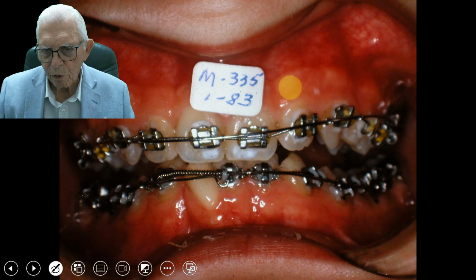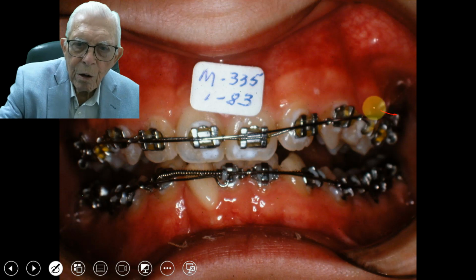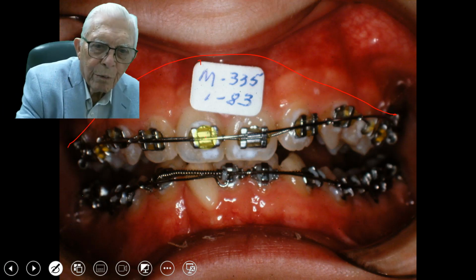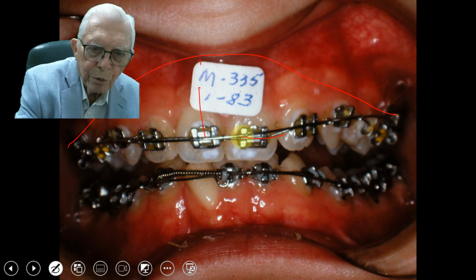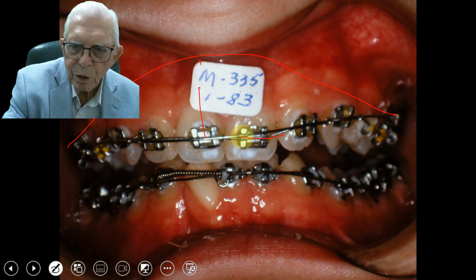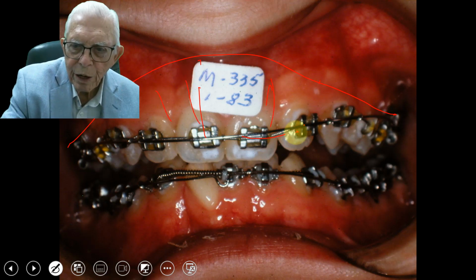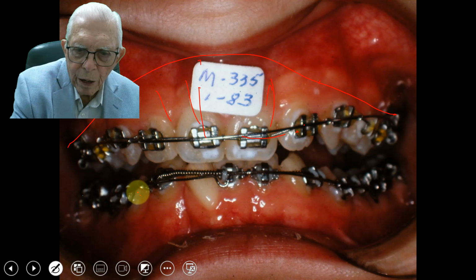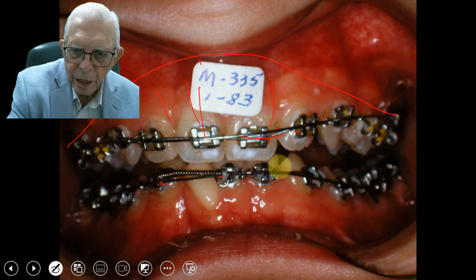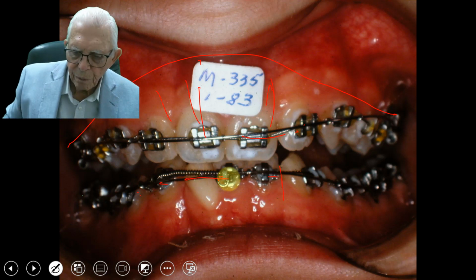Now here we're going to cover how we did this thing. Now this is an intruding arch wire, which goes way up like this, and you're really raising those teeth up. You've got another arch wire in here which rotates the teeth, and we have this one piggybacked on top of that. This wire here is the one that raises this up. The other one rotates and helps the teeth line up and everything, and they're the little flexible wire. Down on the bottom we've got a spring. We're opening that. As we bring this down, we will line these lower teeth up here.